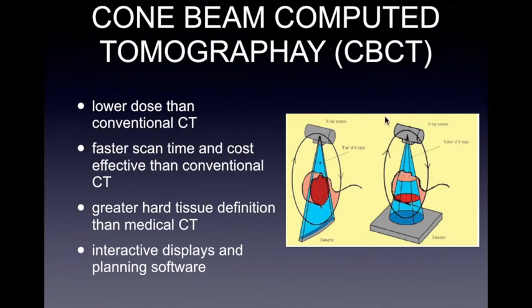This slide particularly shows the schematic representation of the difference between how a CT scan gets its image versus CBCT. It follows the same idea that in order to get a three-dimensional picture, you need to get the picture of the three-dimensional object by getting all angles or sides of that object.